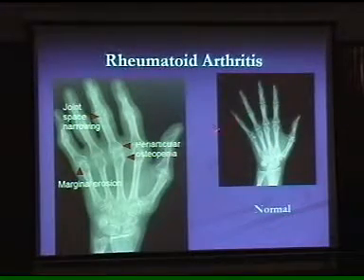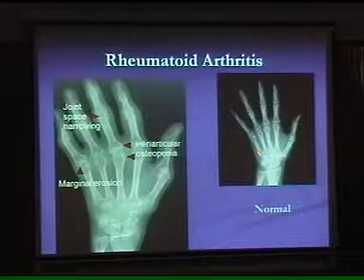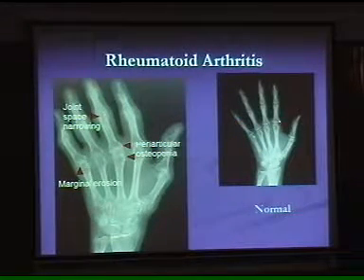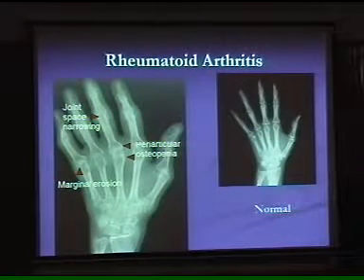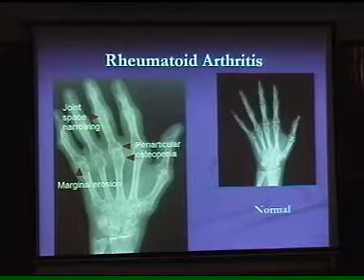I'll just show you. Look at the normal hand. That's the first place where it's going to come out, in the metacarpophalangeal joints. These are the carpal bones, metacarpals and phalanges. That is the first stage you can look at. And the diagnostic sign between rheumatoid arthritis and gout disease is this is subarticular and that is periarticular. That's very, very important.